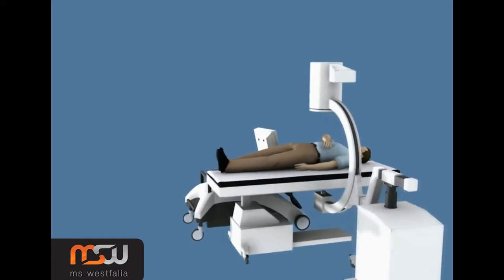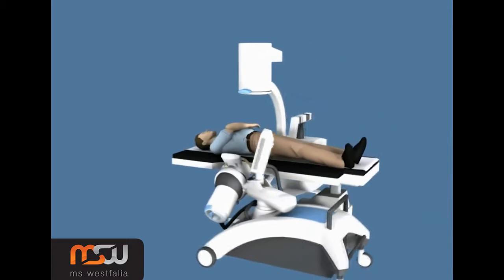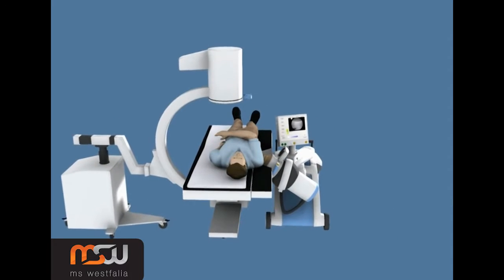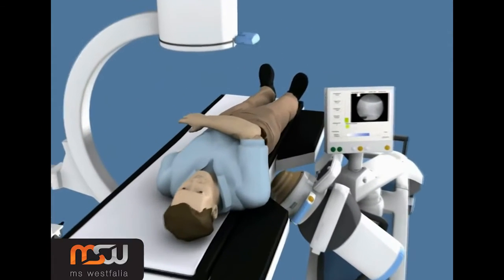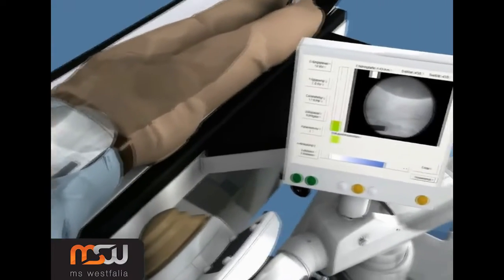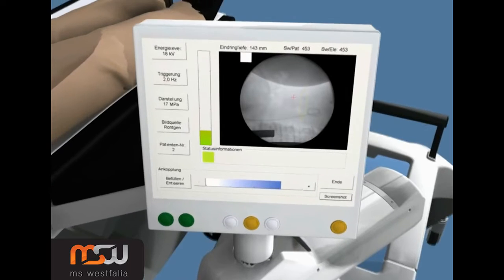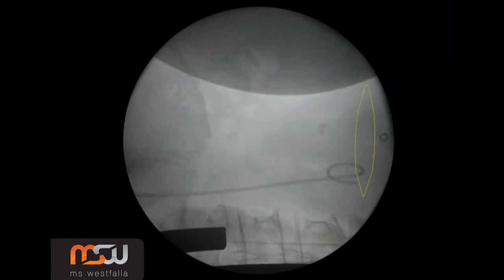We would like to demonstrate a typical process of positioning and treatment by the use of X-ray imaging and Polaris. First, the C-arm and the shockwave source are aligned to each other at a 90-degree angle. Then an X-ray is taken by AP projection. By positioning the shockwave source directly at the visible stone, or by moving the table laterally or lengthwise, the focal volume is aimed onto the stone.